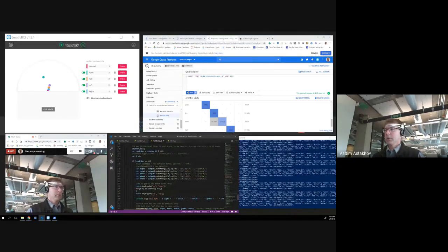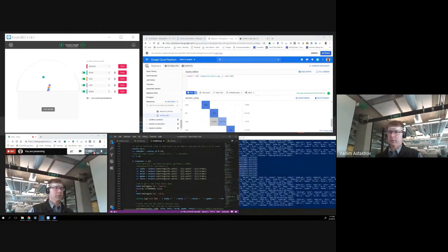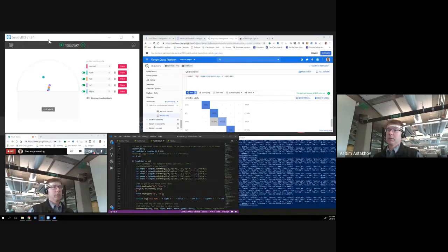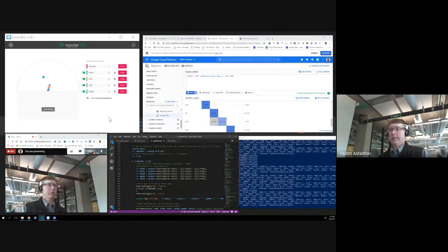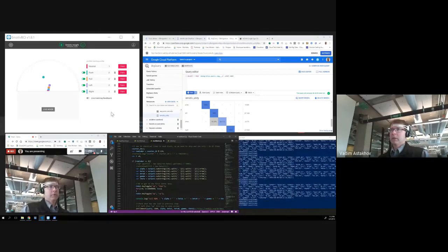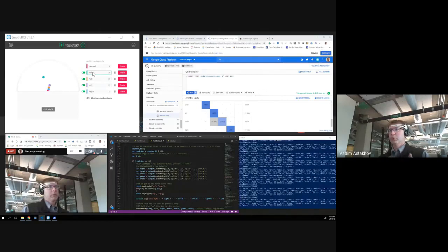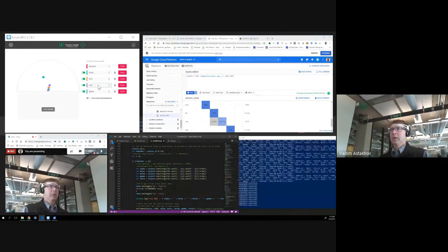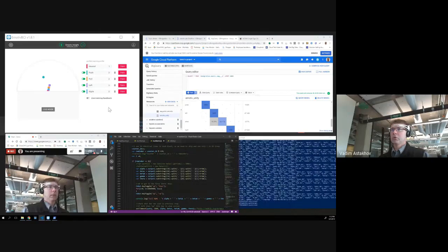Now the question is, how would I collect those raw data, and what's the process of annotating the data? For that, I'm using the Emotiv BCI graphical user interface that provides me with a simple UI to train, basically collect my data for simple mental activities. As you can see, one of the types of activity can be push if I'm thinking about pushing an object or pulling an object. Also, I can be thinking about pushing it left or right, and I can also add more commands if I need to.